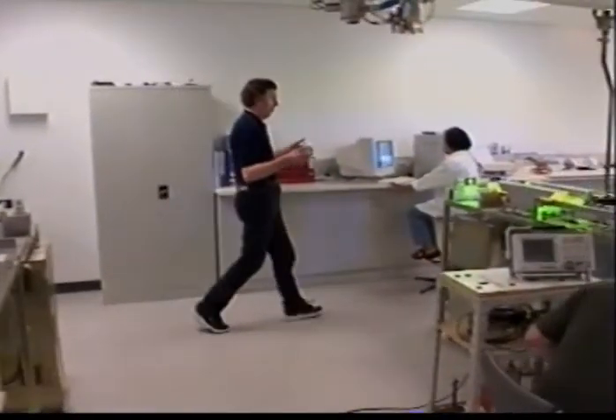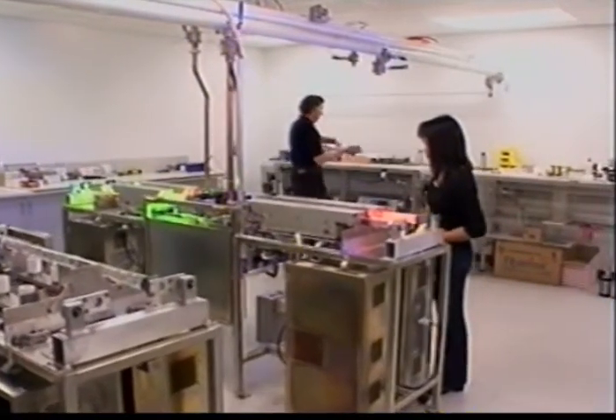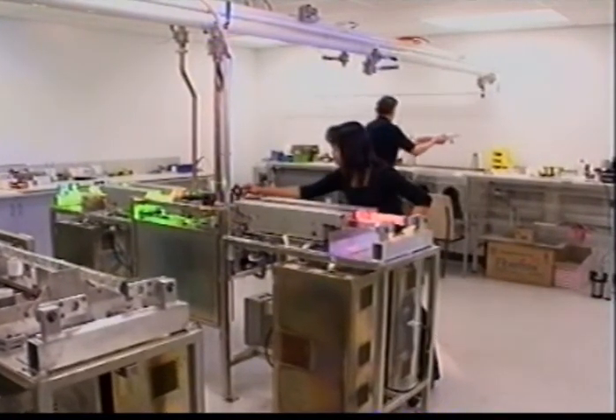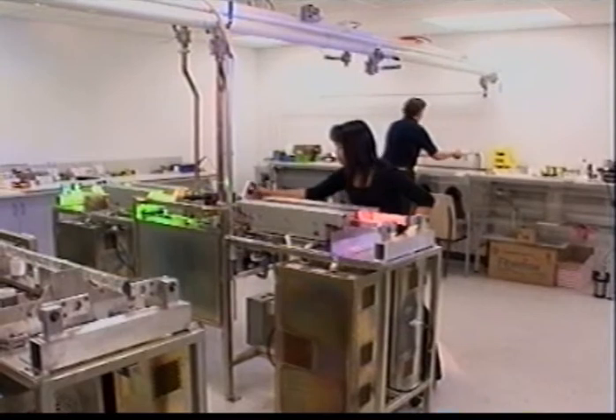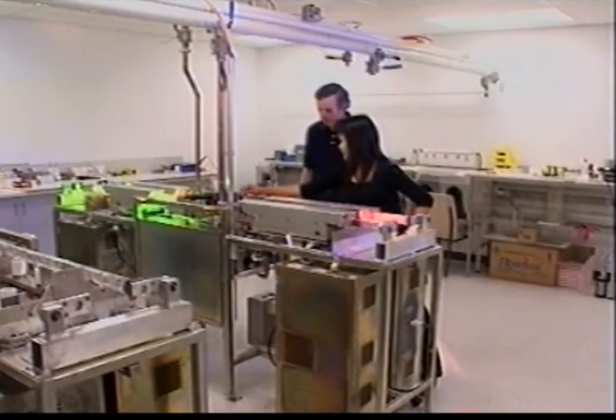After final assembly of the complete system, the finished lasers undergo an exhaustive series of tests which take even longer than the manufacturing process itself. The medical lasers in particular have to conform to a number of international standards.